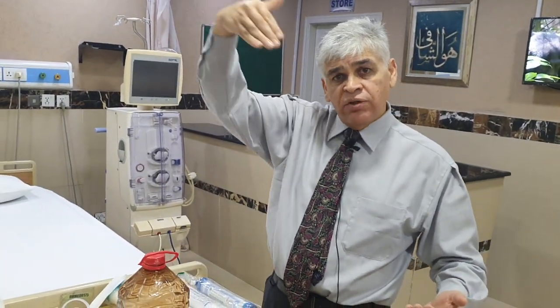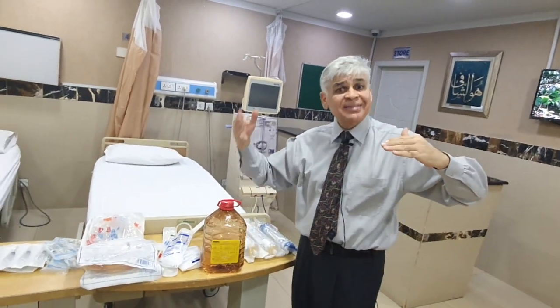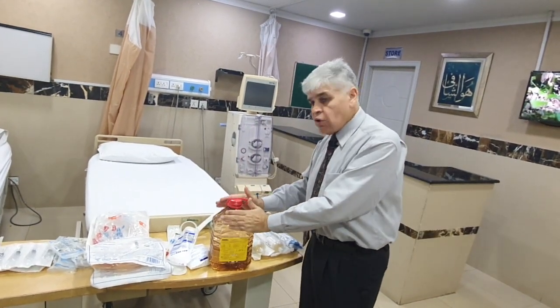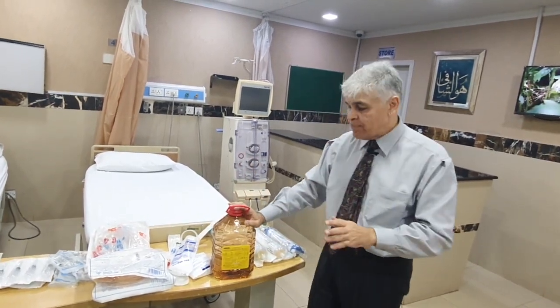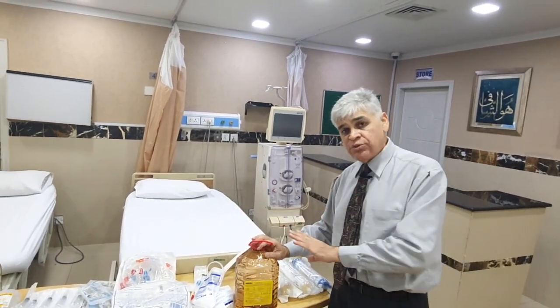So the 200 blood sugar will drop down if you haven't got anything to counterbalance that on the opposite side, and that is with your A part. When it falls down, the person will become hypoglycemic, and that's one of the problems. Hypoglycemia is a major problem in dialysis patients because of fluctuations. So all of your dialysis solutions, the A parts, contain everything that the person needs. They have to have sugar. You can add in more sugar artificially, you can get concentrates which have more sugar in them, but it has to have sugar.